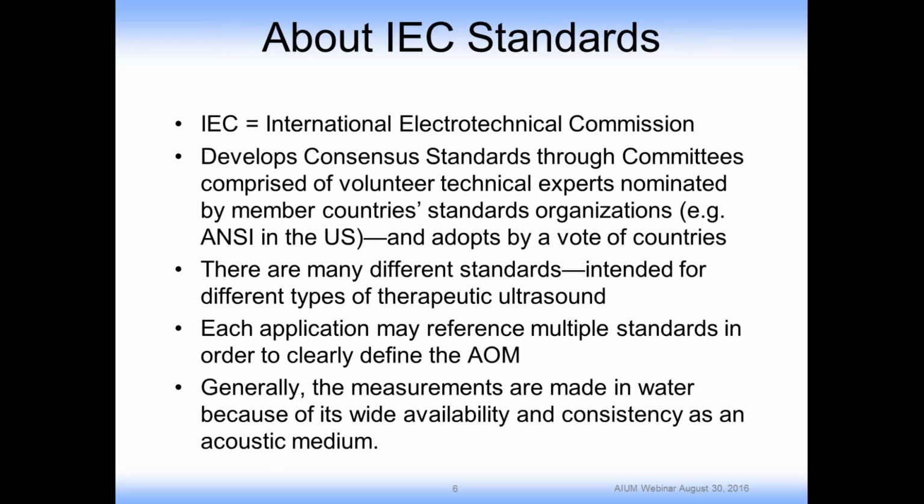So I'll take a moment just to describe what IEC standards are. IEC stands for International Electrotechnical Commission. This is a group that develops consensus standards through committees comprised of volunteer technical experts who are nominated by member countries' standards organizations. For example, in the US, there is the American National Standards Institute that basically designates experts who work with the IEC. And then such standards are adopted after a vote from the member countries.